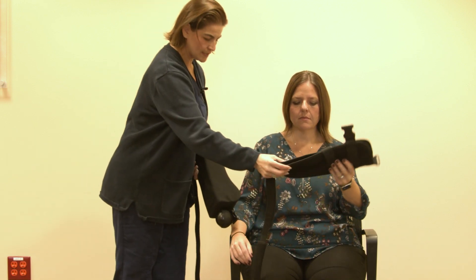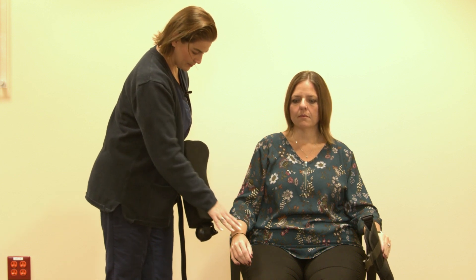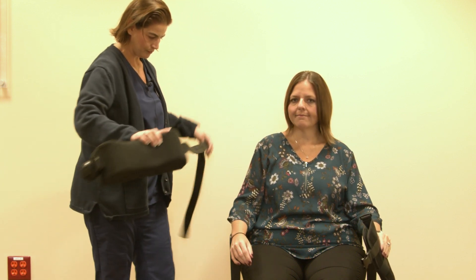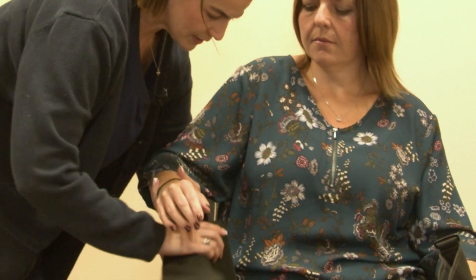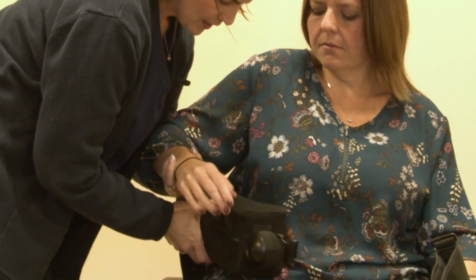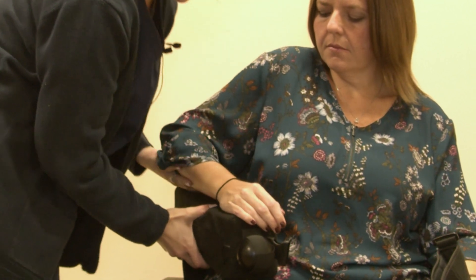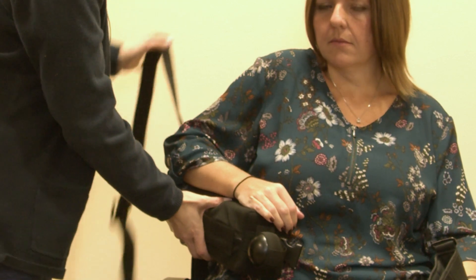I'm going to ask Brittany to hold this while I put her affected right arm in the sling. I'm going to support her arm as I gently place the wedge between her body. I'm going to place her arm on top of the wedge just while I place the strap around her waist.